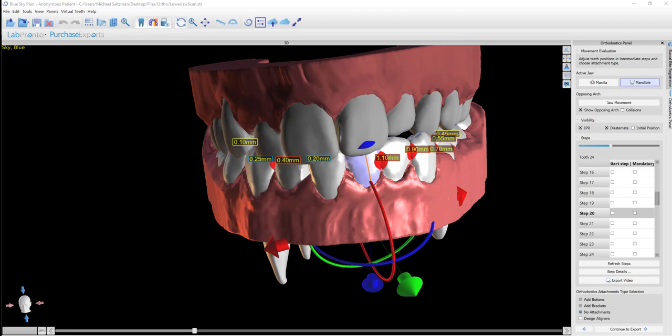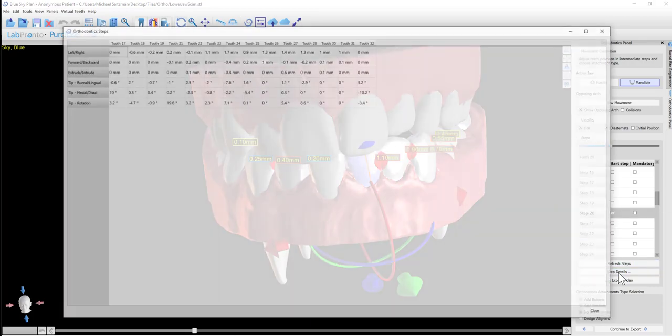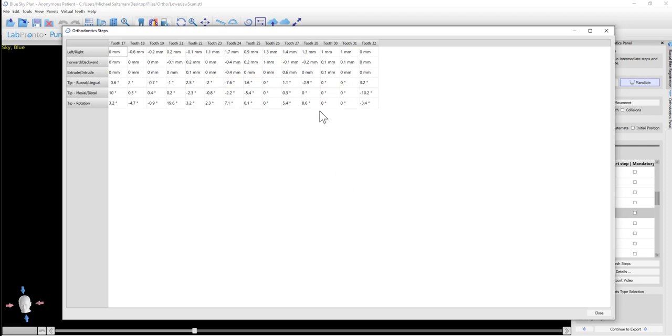At any given step, you could highlight the step and then click step details, and it brings up on the screen all the movements for any tooth during that step. So it shows you all of that data.